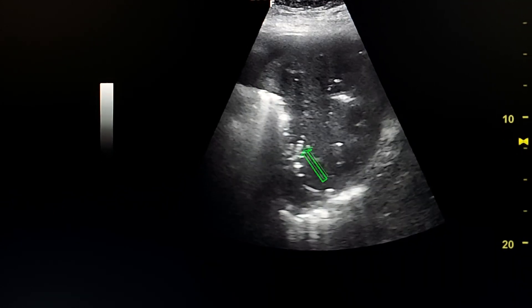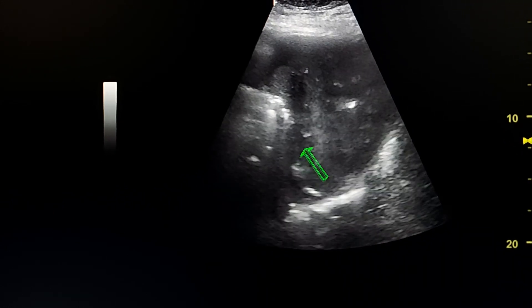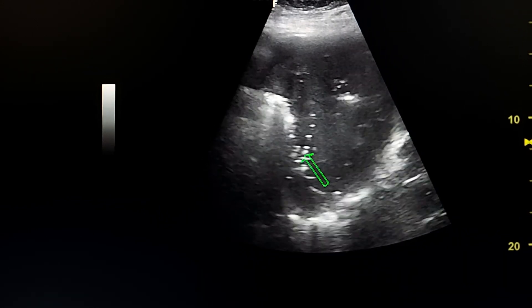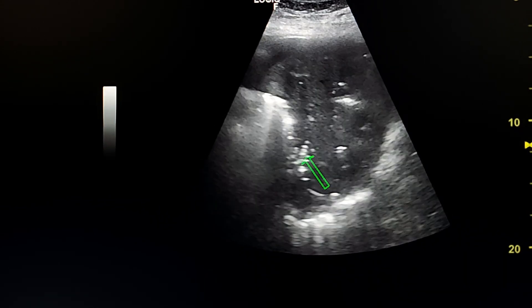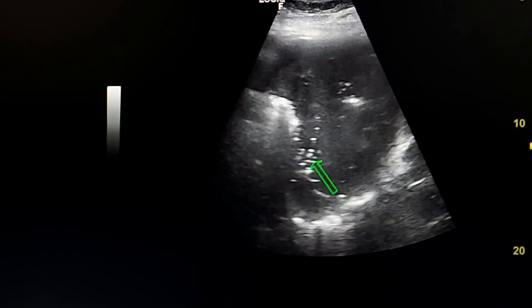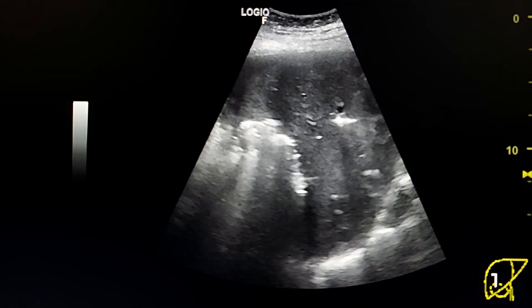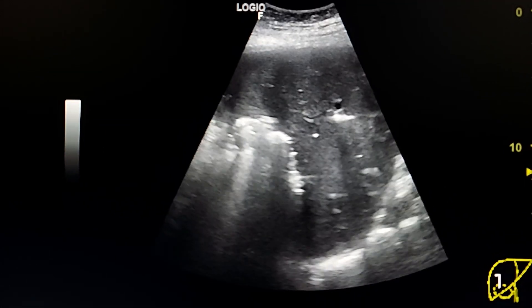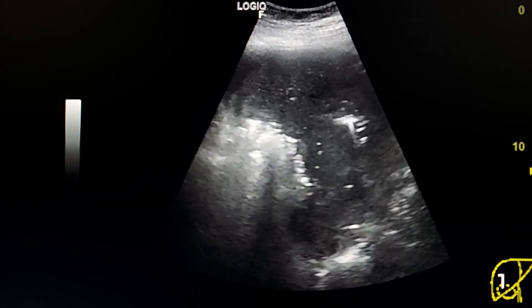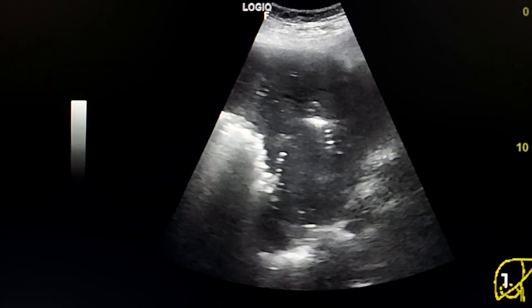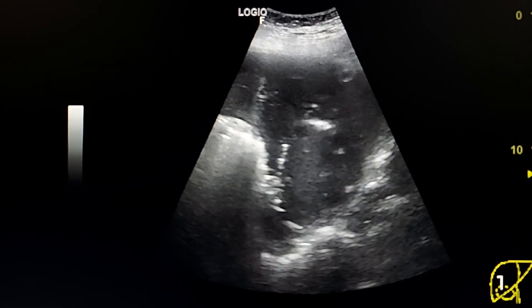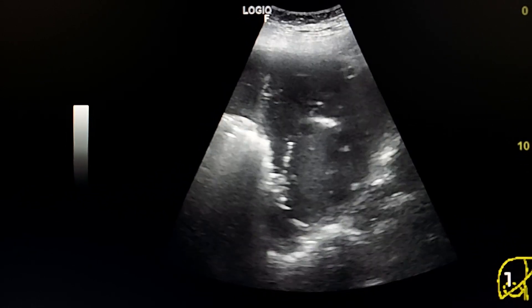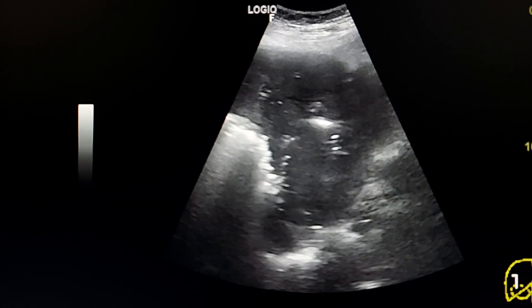Here we see leaking of gas bubbles into the hepatic veins. This is a rare finding to see by ultrasound.